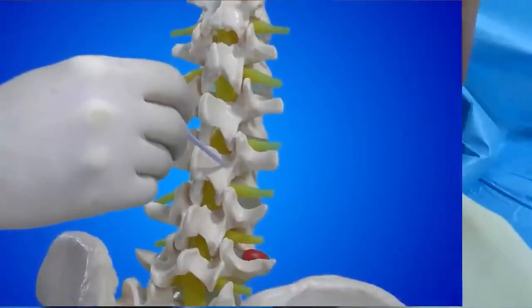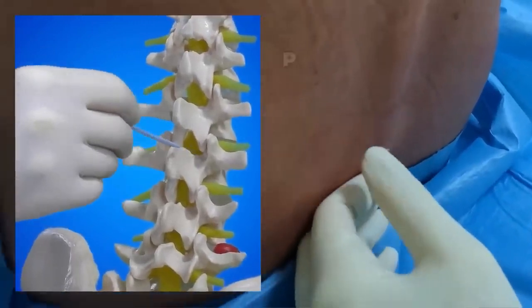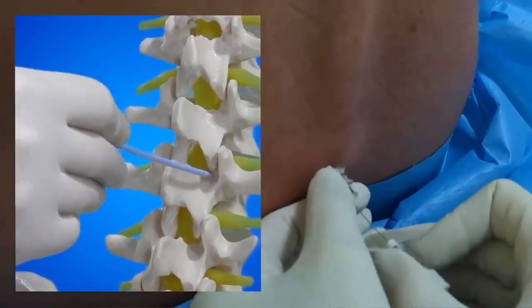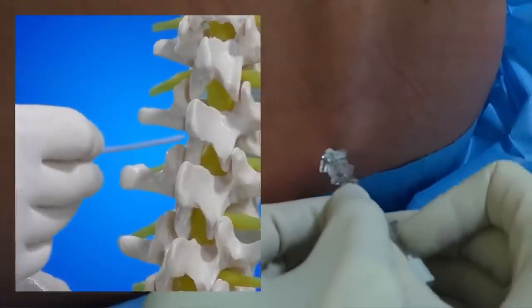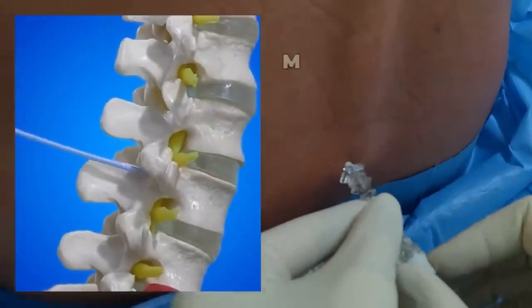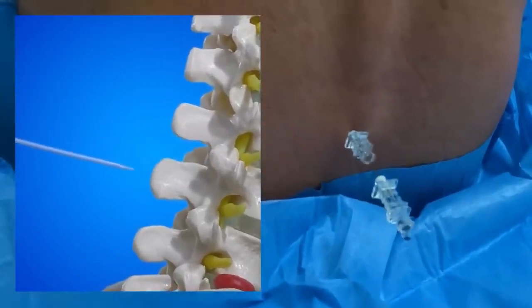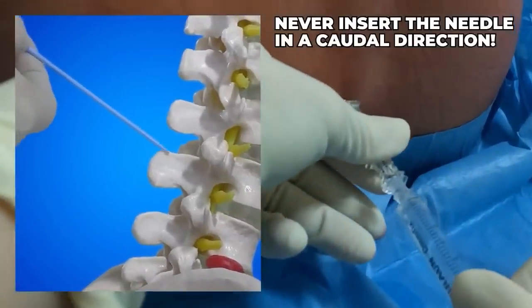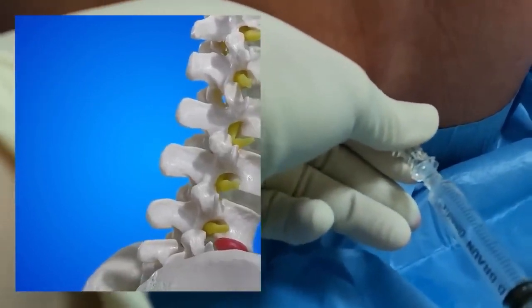In this case, we need to withdraw the needle to the skin and do what I call micro directions: laterally one side, laterally the other side, or slightly cranially. But again, the key word here is micro directions. Never caudally, because the needle can never enter the intrathecal space if you reorient your needle caudally.